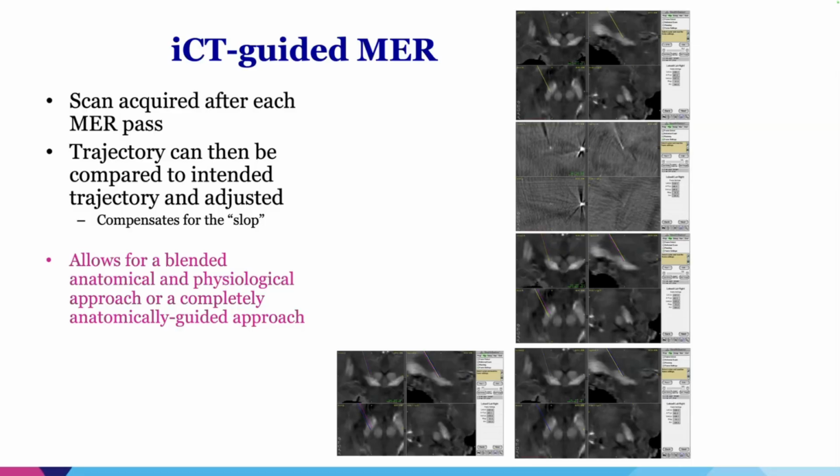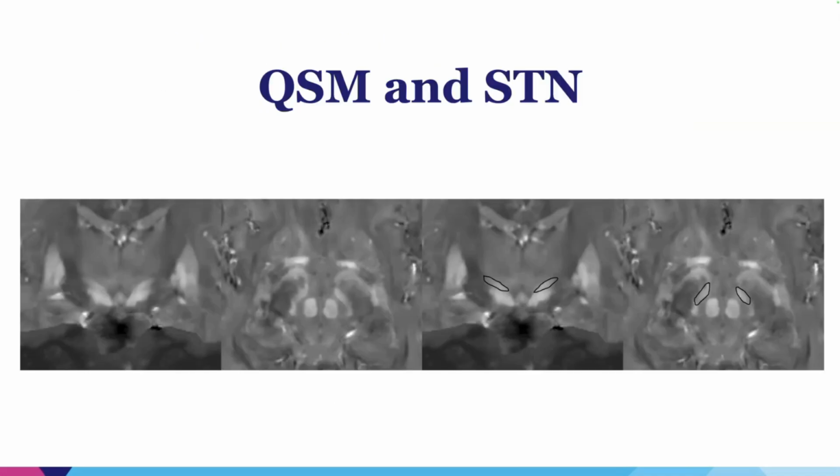We also still do a lot of research in my operating room that requires microelectrode recording, among other things. But this intraoperative CT approach, I think, allows for a blended anatomical and physiological approach that is nice and flexible. With regards to the STN use case, an example of STN on QSM is seen here.